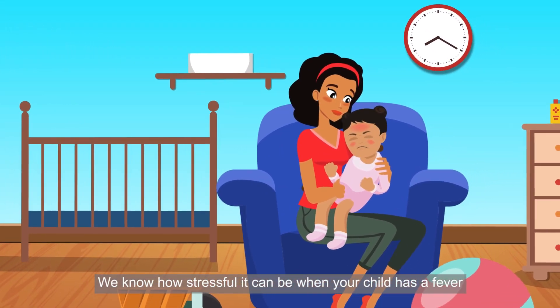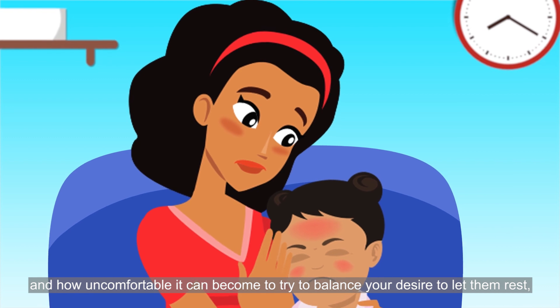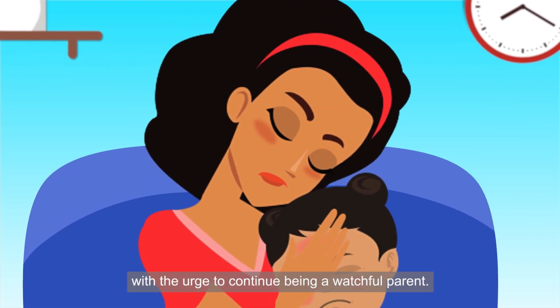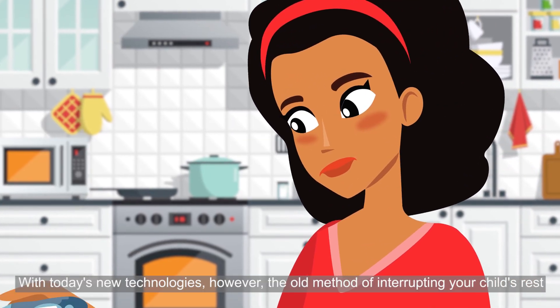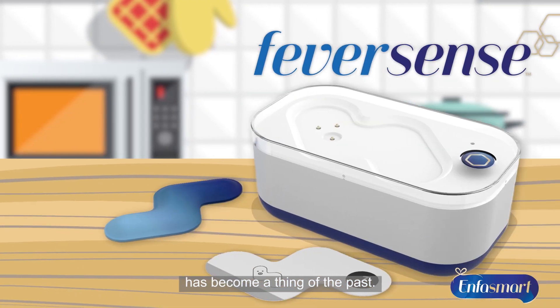We know how stressful it can be when your child has a fever, and how uncomfortable it can become to try to balance your desire to let them rest with the urge to continue being a watchful parent. With today's new technologies, however, the old method of interrupting your child's rest to get a new temperature reading has become a thing of the past.